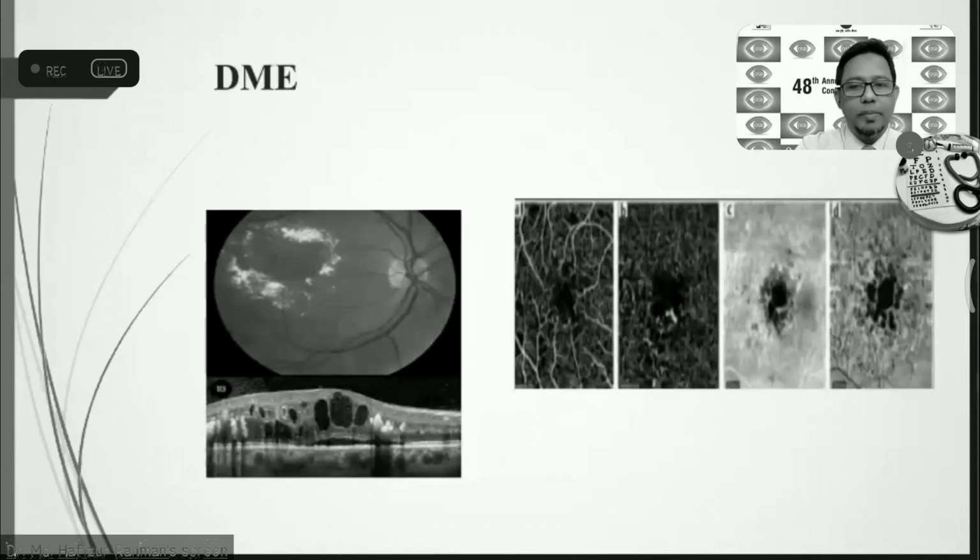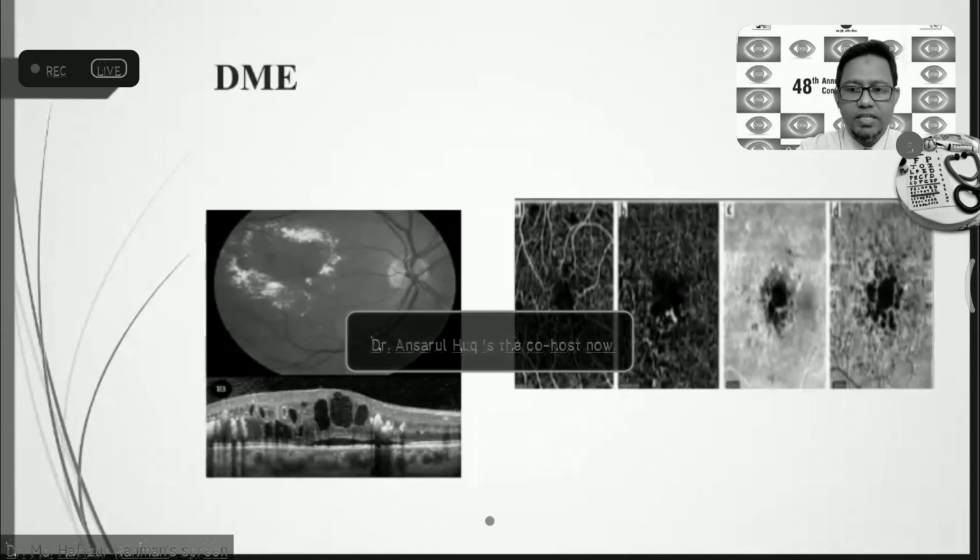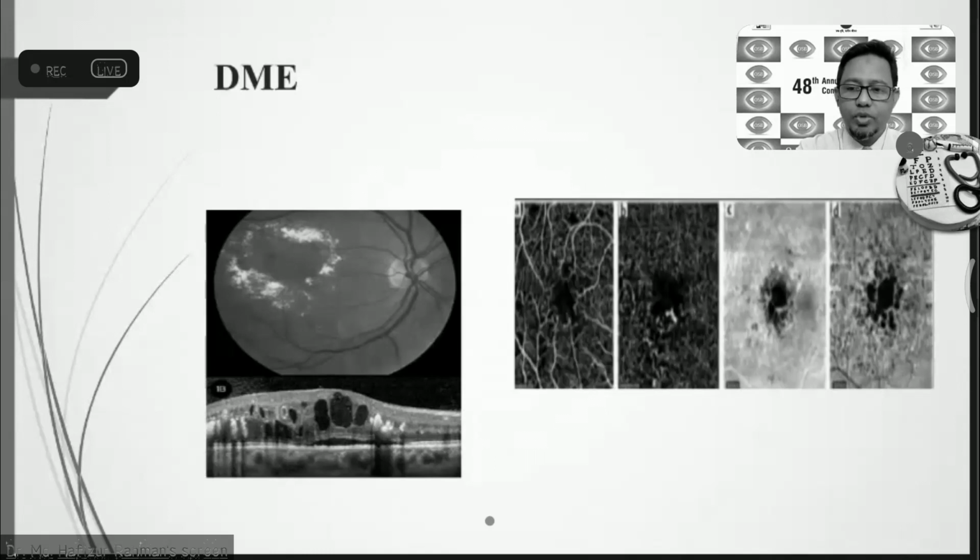In case of diabetic macular edema, OCT angiogram shows, and here the pictures showing the color fundus and vertical OCT and all layers of the OCT angiogram. But I only highlight the OCT angiogram. OCT angiogram showing the vascular loops and cysts in both superficial and deep plexus. Scan passing through the deep capillary plexus shows more pronounced cystic space associated with the capillary impairment. It is noted that there is no capillary network within the cystic space.